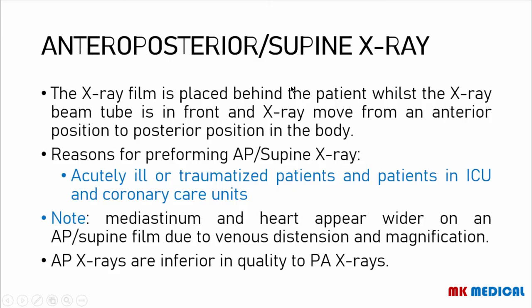Then moving on to the anterior posterior or supine X-ray. So this is a film that's going to be placed behind the patient, and the X-ray beam is going to be moving from the front of the patient towards the back. So it's going to be entering in an anterior aspect, and leaving in a posterior aspect.